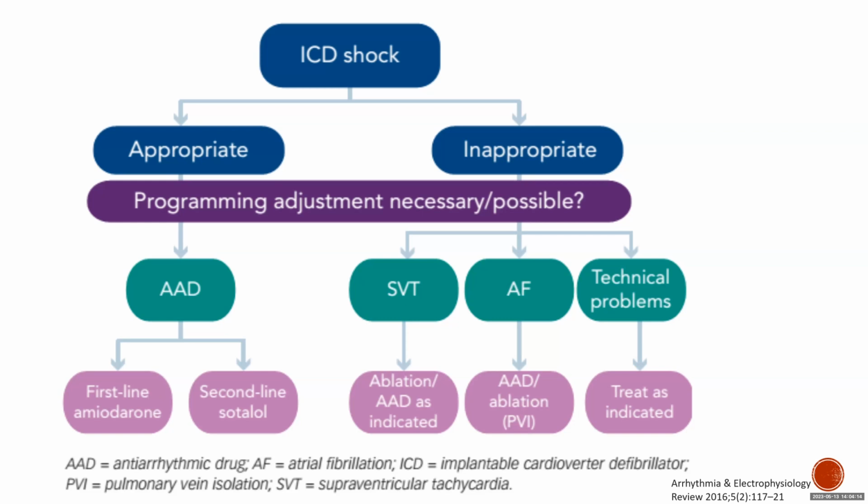What happens sometimes, once there's a device, people can get a bit confused about, oh, the device will deliver shock, or let's wait. You just assume there's nothing there, and you manage the code as if there is no device.